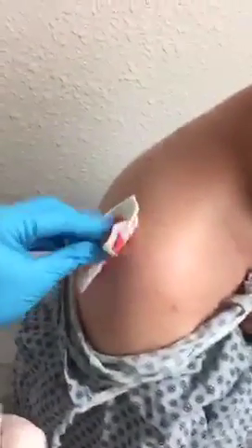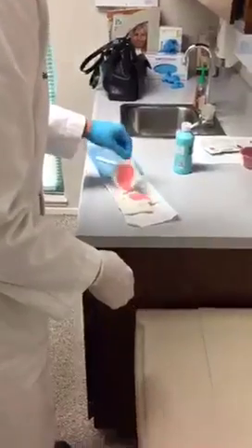All right. So notice I'm just using the part that's sterile. But you can't see it. That's why I don't like it as much as the iodine. Or it goes on clear then. Well, fairly clear. Yeah. I'm sorry. Am I keeping you guys from seeing what's going on because of the position? Oh, this? Yeah. Thank you.